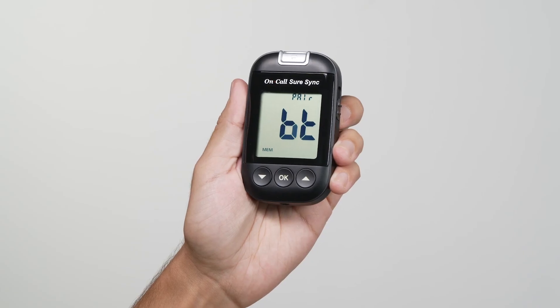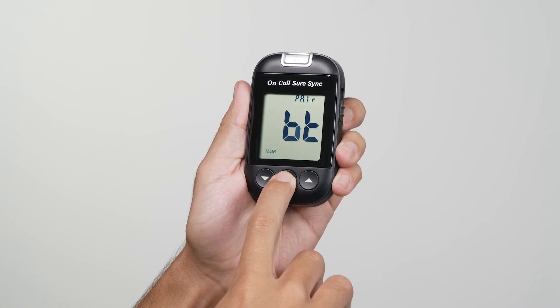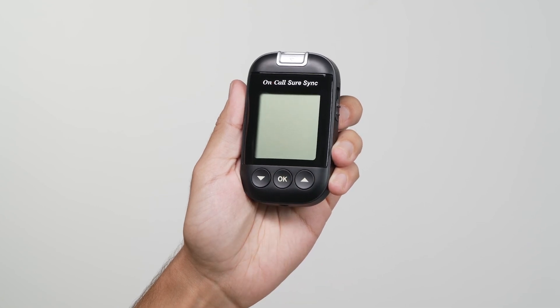Press the OK button to exit the setup, or the meter will automatically shut off after 30 seconds of inactivity.